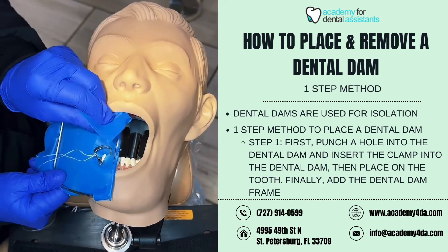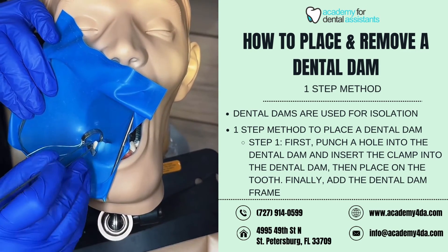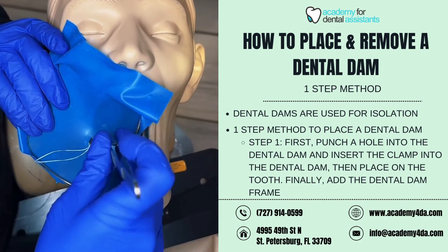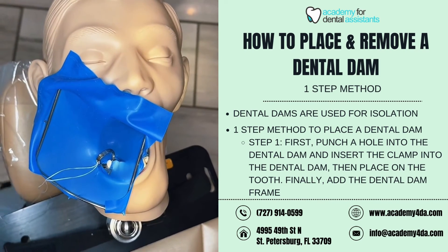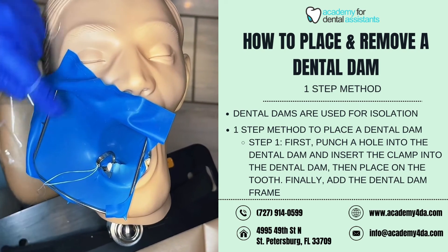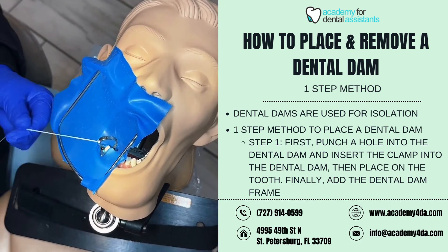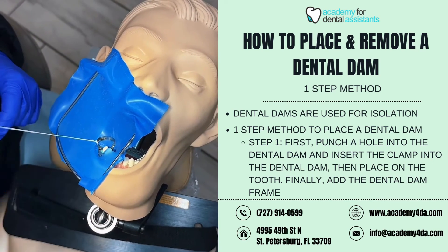I'm going to grab my ligature and get it out of the way. This will come out of the patient's mouth. Using my cotton pliers, I'm going to make sure it is pulled tightly around the tooth. I can also use a piece of floss — sometimes cotton pliers are a little too rough — so I'll floss in between the mesial and distal walls to make sure it is fully secured. Make sure your ligature is coming up and out of the mouth.